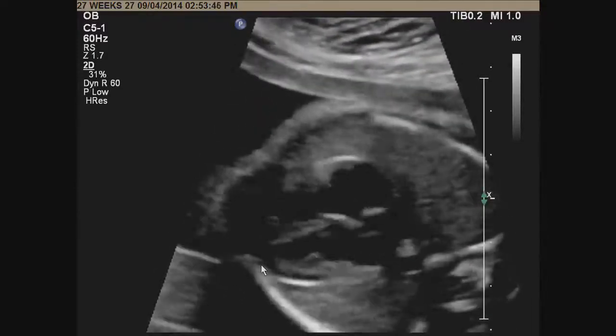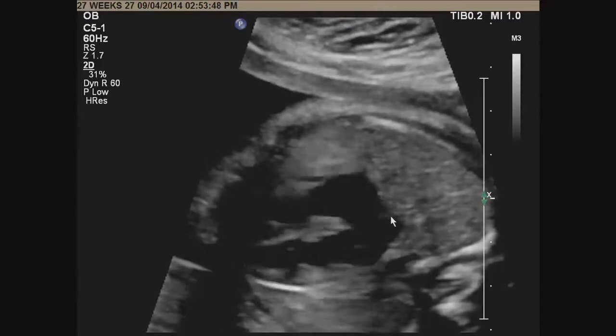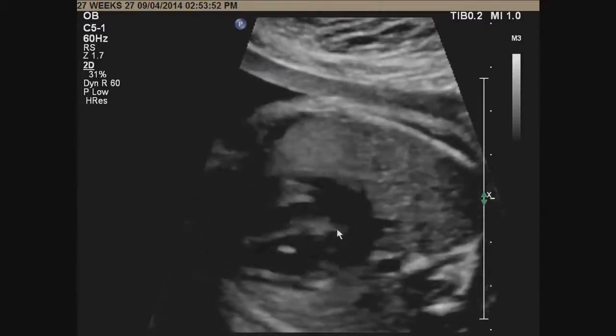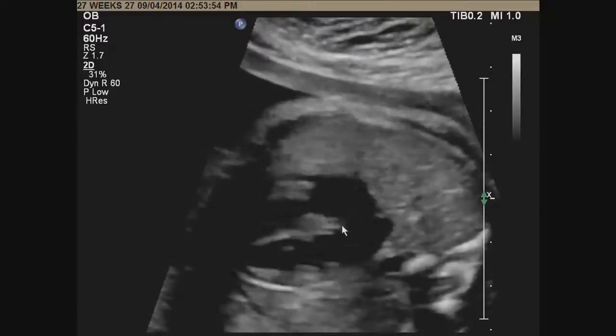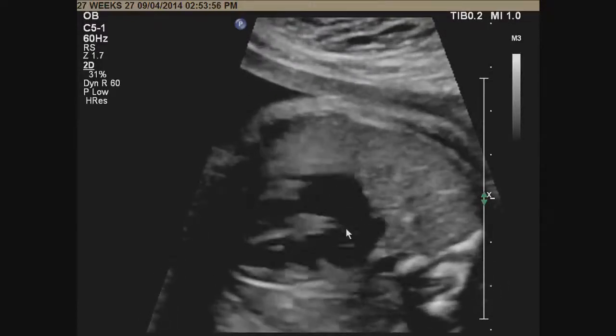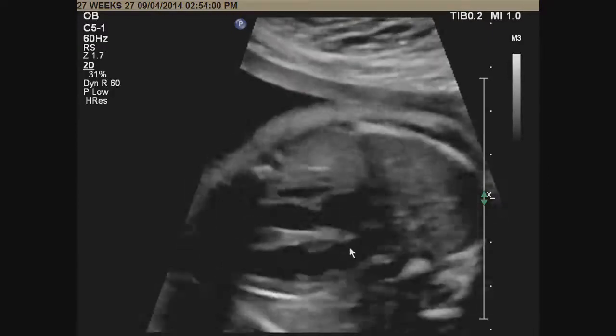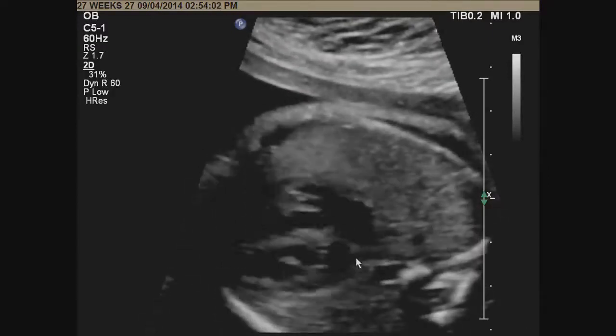So I'm going to come in a little bit at an angle. Now I'm going to look at the atrial and ventricular septum. I'm going to look at the atrial septum right here. This is the septum primum area. I want to see that this is intact. Here's your foramen ovale, and you see the leaflet of the foramen nicely opening from right to left.